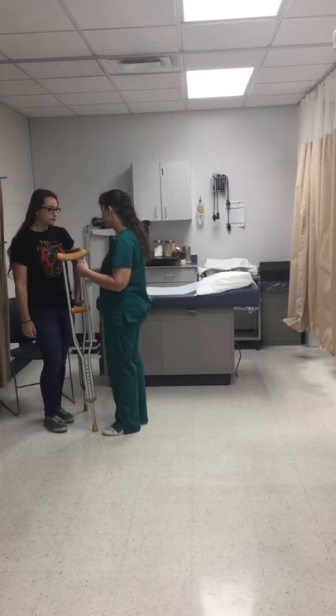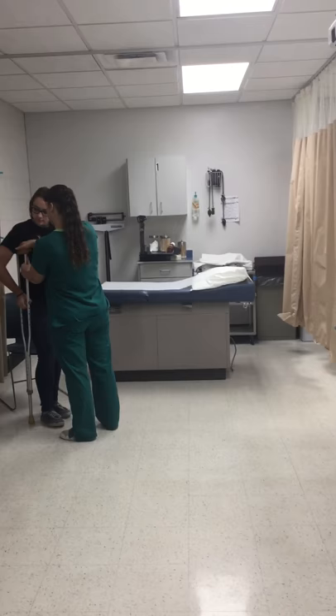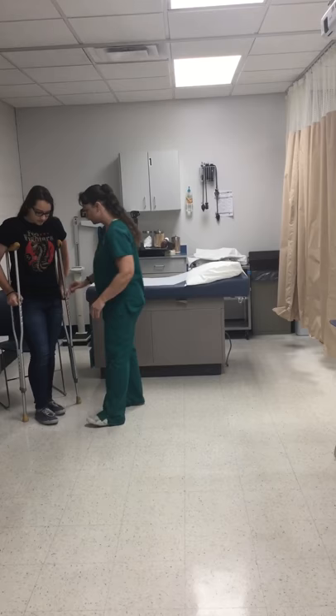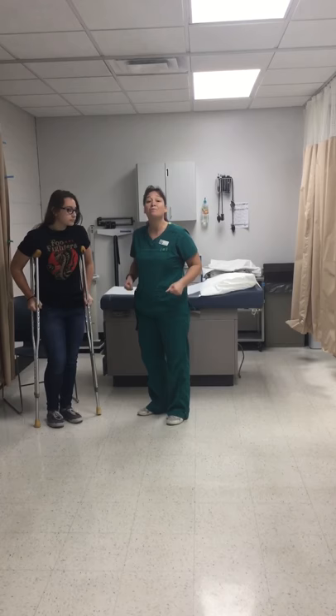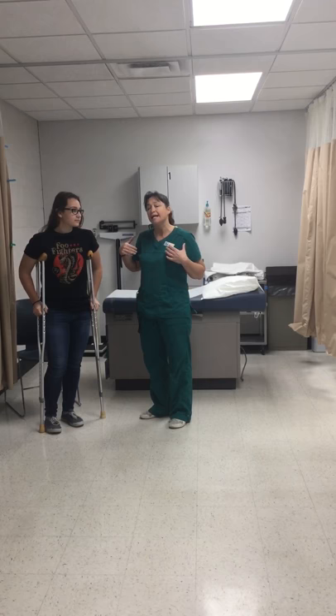Let's see how these fit for you, Erin. Let me know if they bother your armpit — they might be a little bit high. We want to make sure the patient's elbows are bent at between 15 and 30 degrees, somewhere around a 20-degree angle. These look pretty good because we want her weight on her hands, not her armpit. If she puts weight on her armpits it can cause problems with circulation, nerve damage, etc.